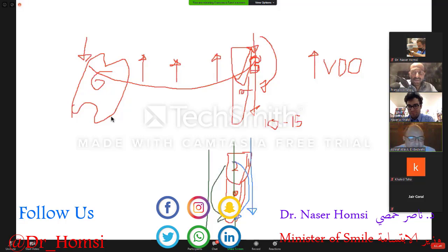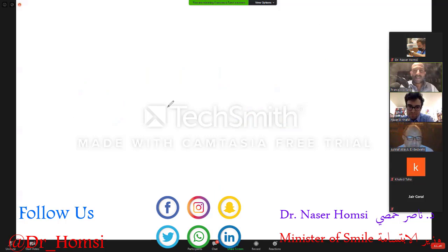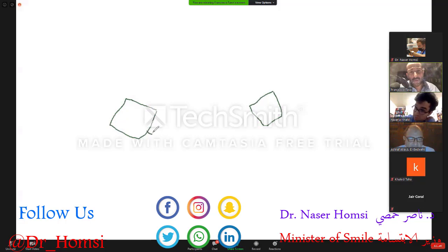Dr. Amri Mbabi asked how to activate a transpalatal arch for molar derotation and expansion. A good idea, a good option can be to create a passive transpalatal bar. I want to draw it in blue, this nice blue. Yes, you are clever in drawing.